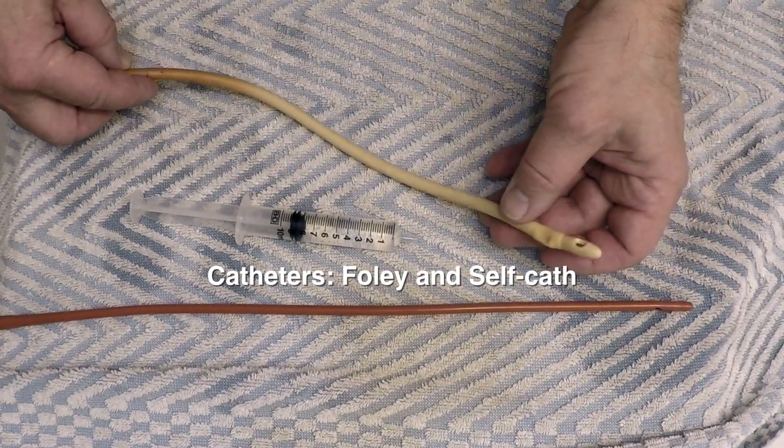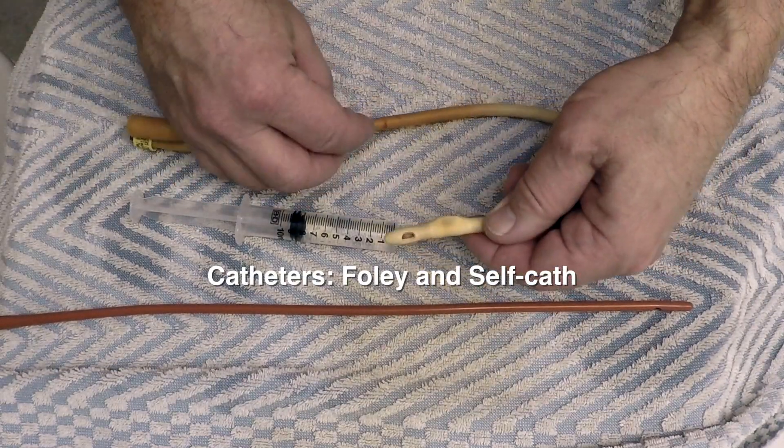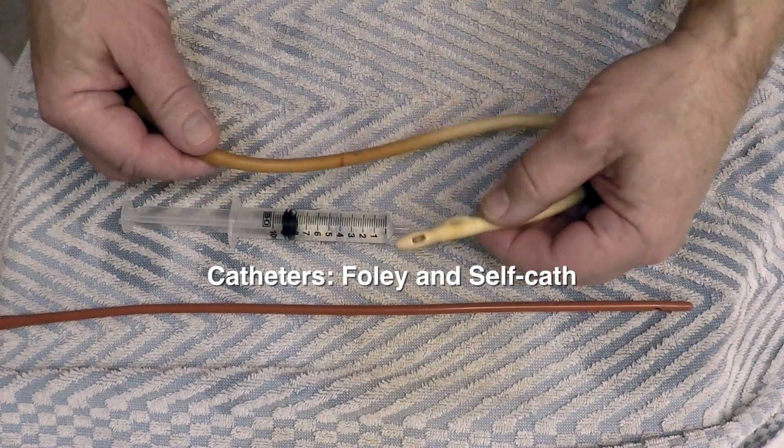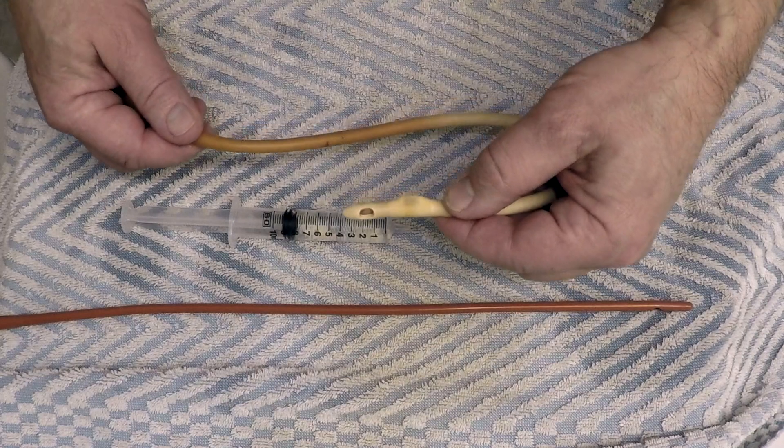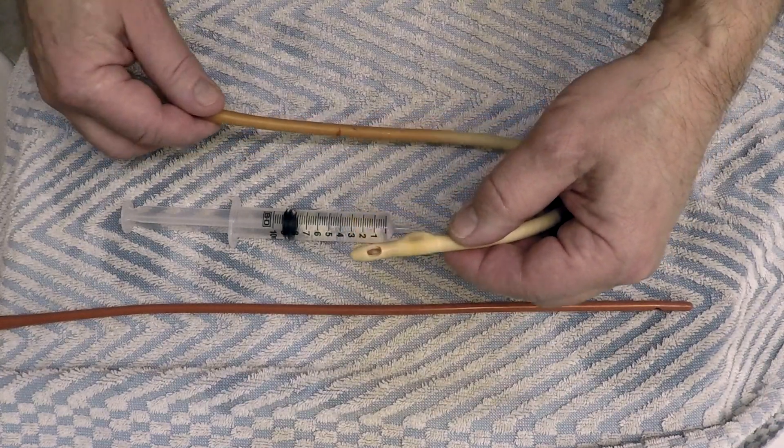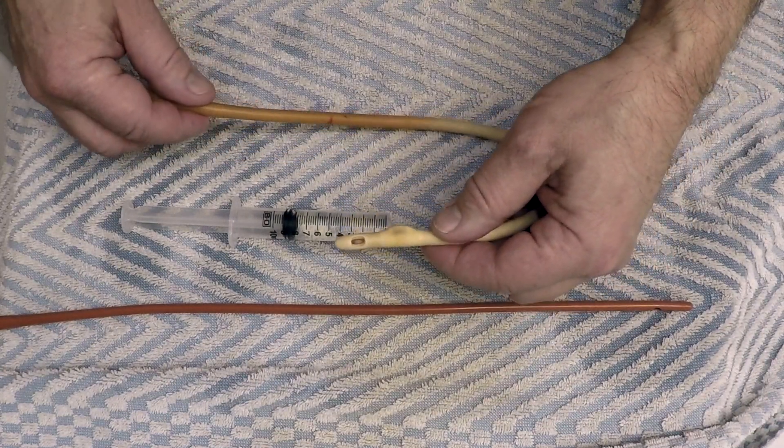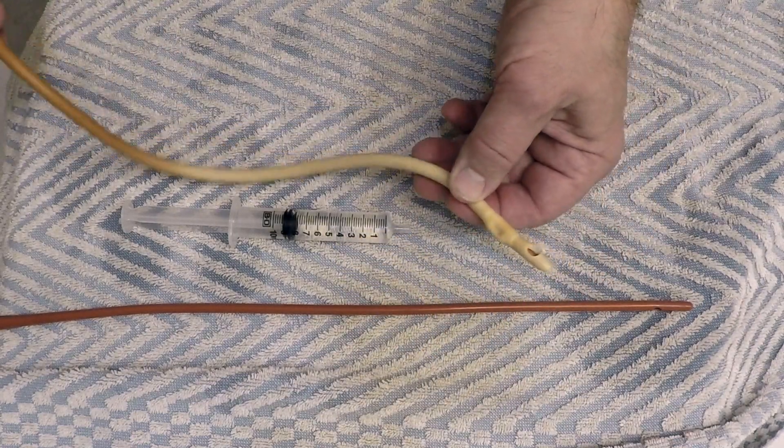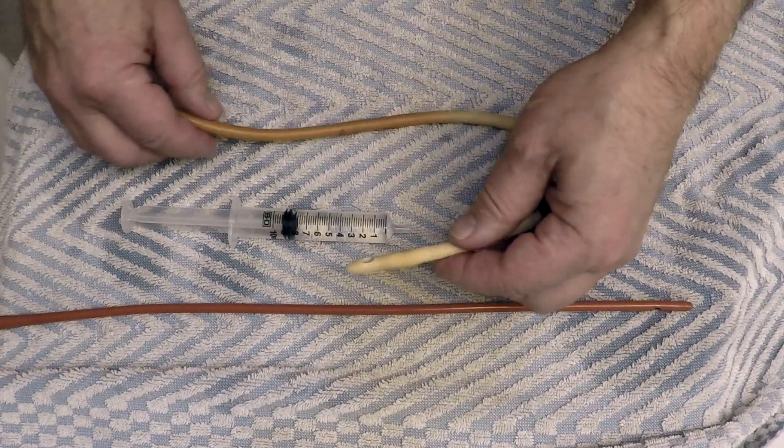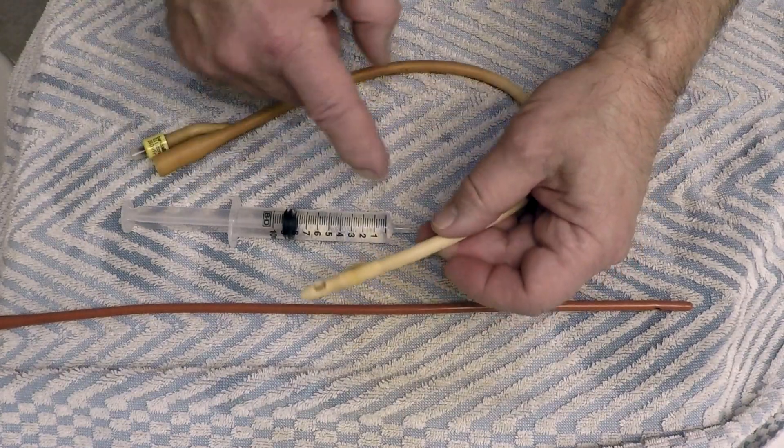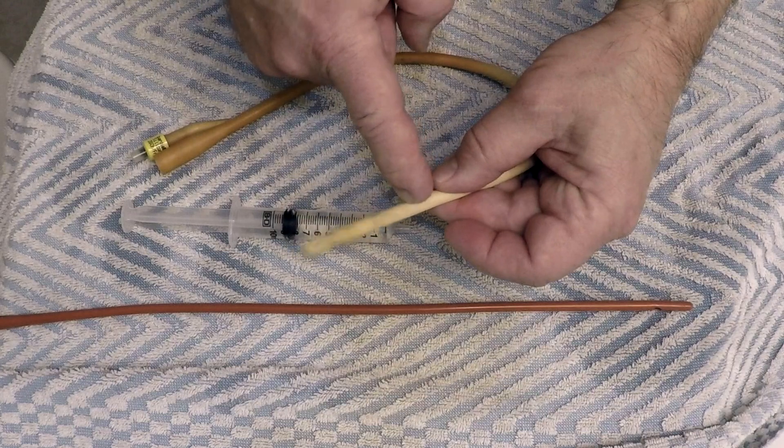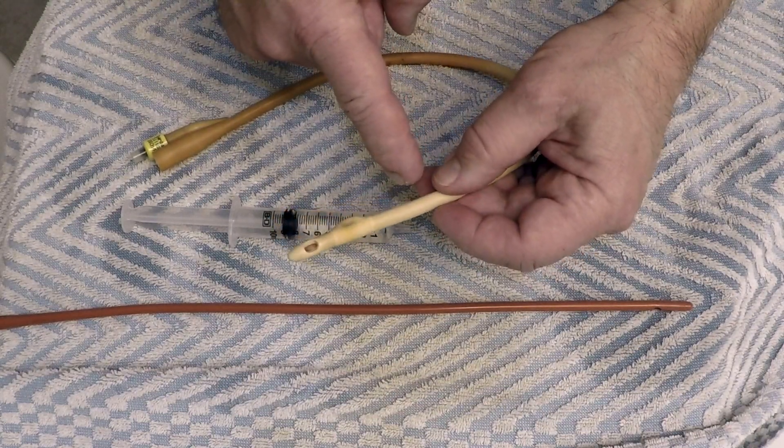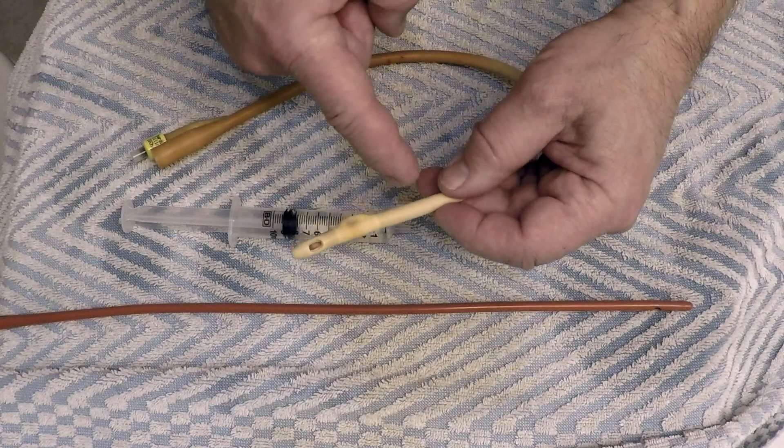Here's a shot of the Foley catheter that I just removed. This has been in there for a week and I was getting tired of it. It was getting to be a bit annoying and itchy. I was only supposed to keep it in for a week just to keep the bladder neck open because I just had bladder neck surgery because of scar tissue growth.